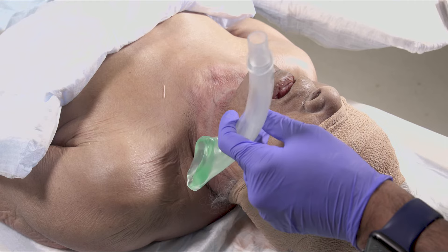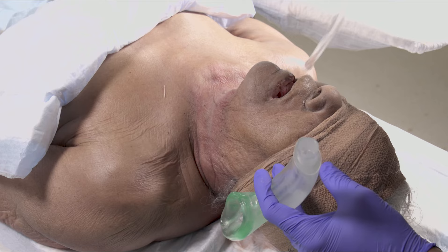Coat the sides, the back, and the tip with lube. Then place the patient in sniffing position and suction the oropharynx.